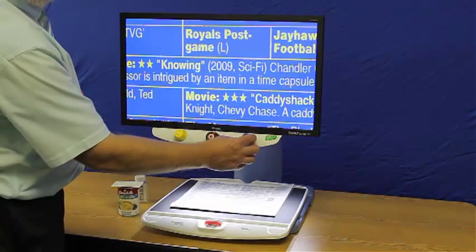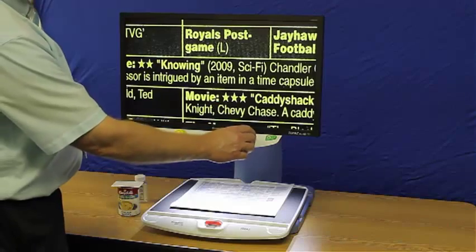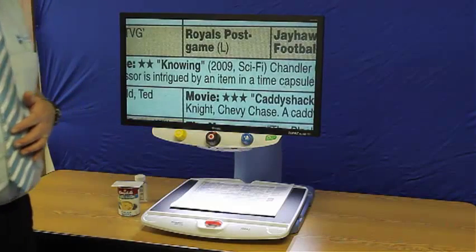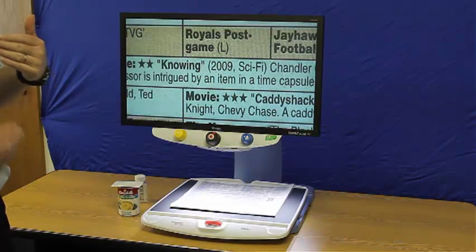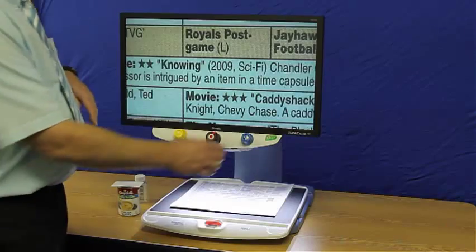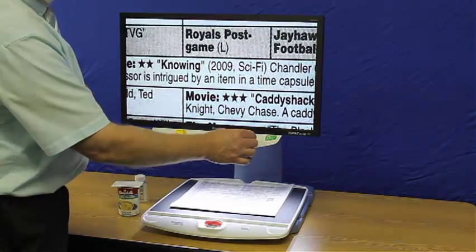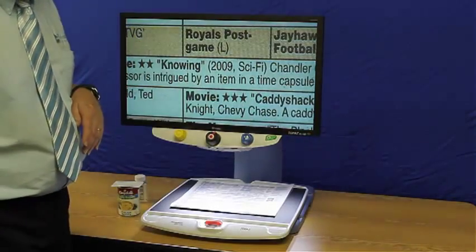This is a yellow on blue. Here's a yellow on black. And then we're back to our original colors. We can have up to 12 different colors set up at any specific time. You can go back and forth if you're in color. You can go black and white, and then you can go back to where you were in color before too.